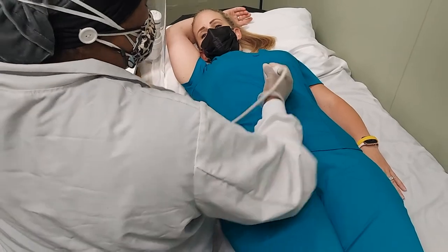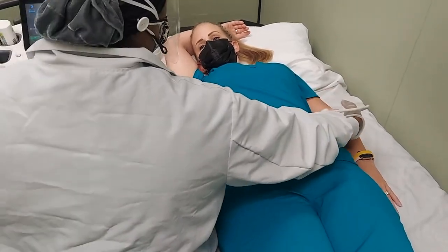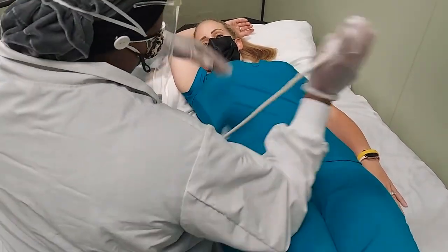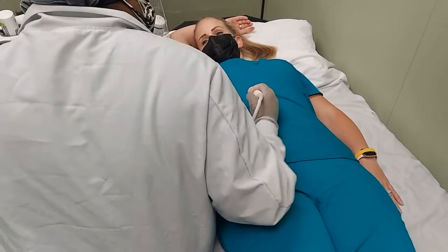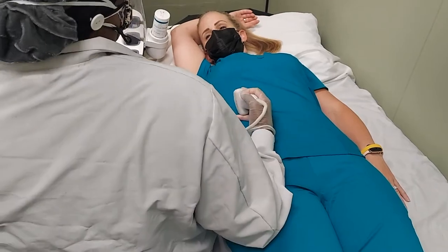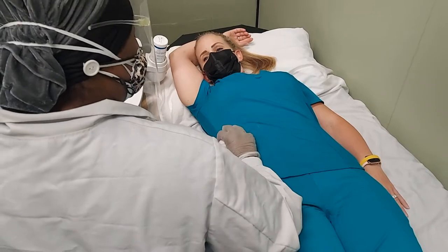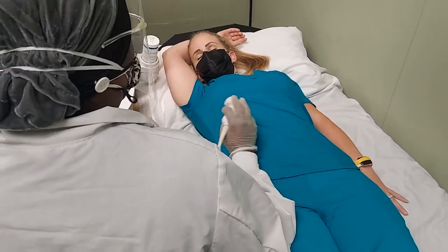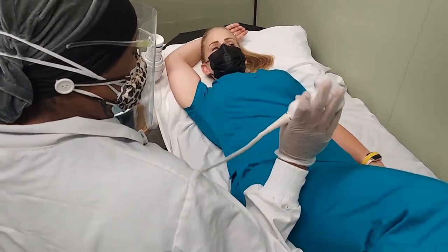In some instances you will not be able to have this done, but this is when you go portable or the patient is not mobile. Having the patient close to you prevents you from having to press hard on the patient. You're able to move the transducer easily in your hand and you're not having a lot of shoulder movement.